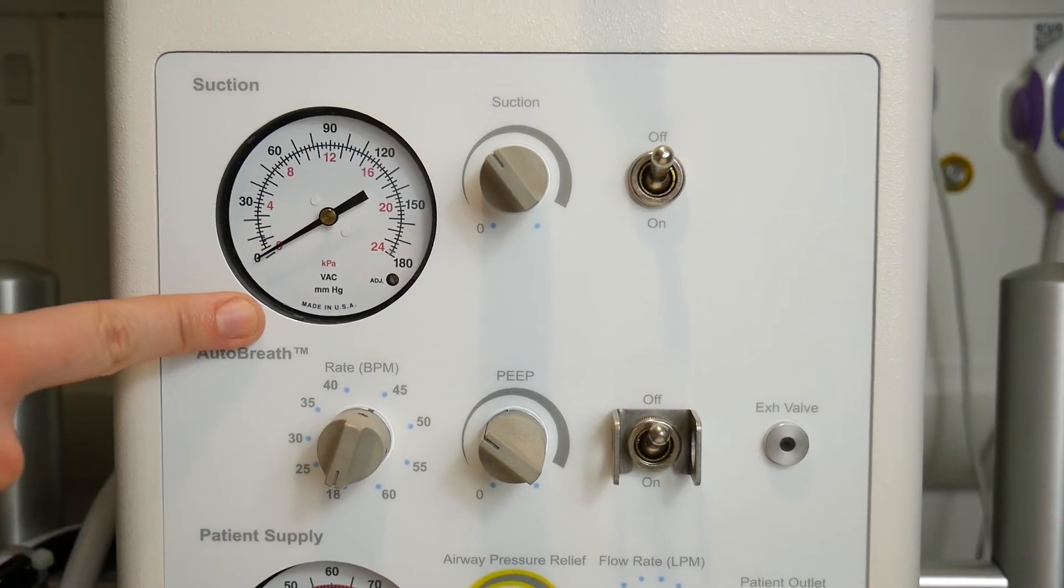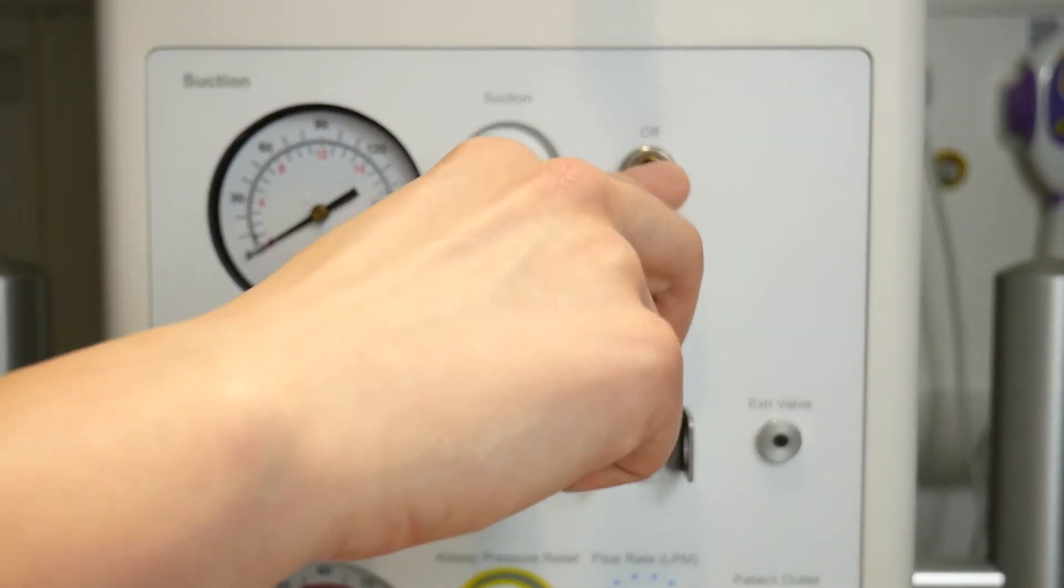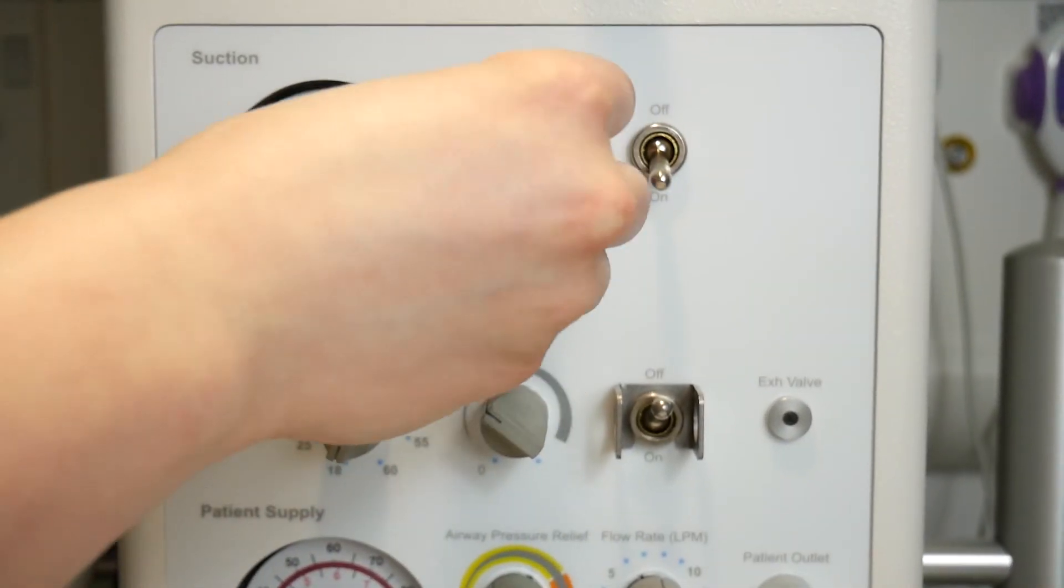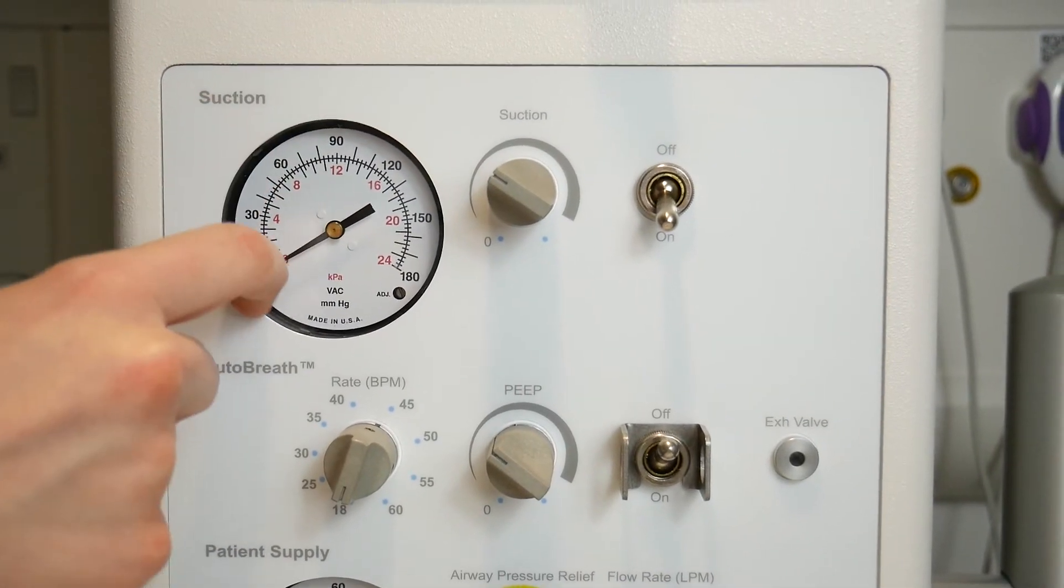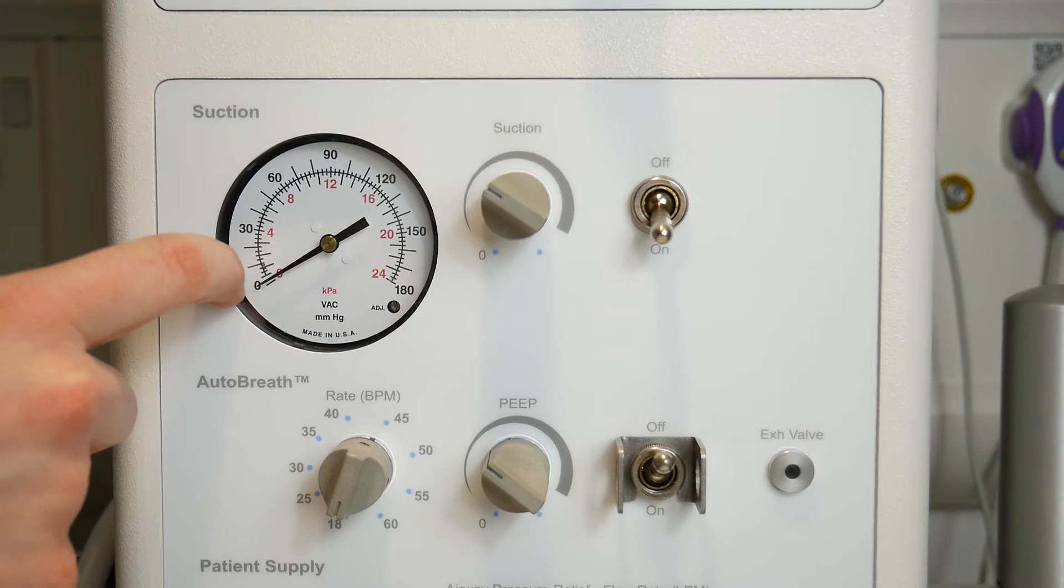This row corresponds to the suction. You turn it on using this switch and then increase the pressure by turning this dial. When you occlude the suction device, this needle will move to show how much negative pressure is exerted.